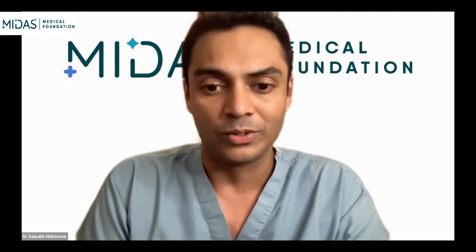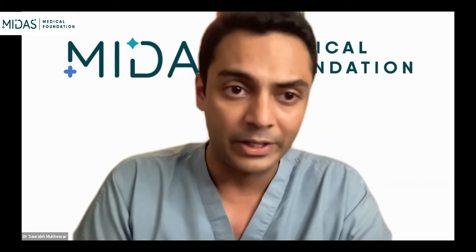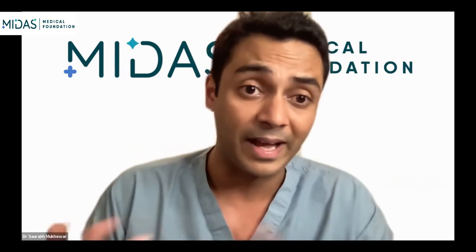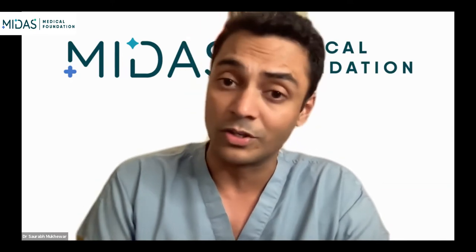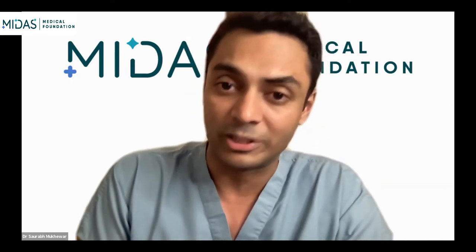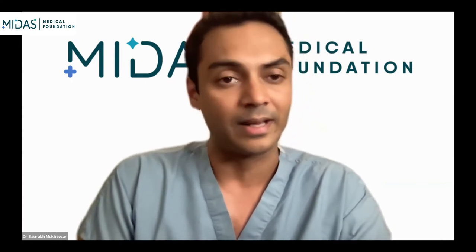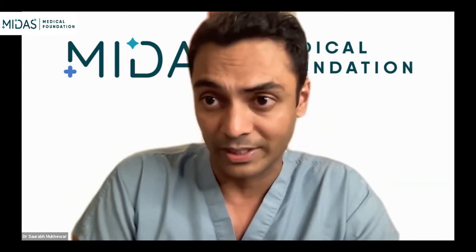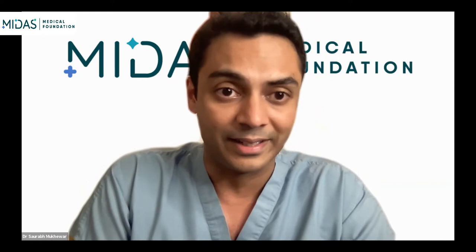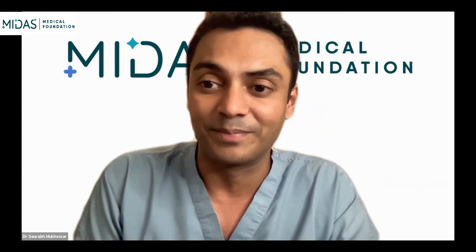There will be demonstration of how regular upper EUS is performed, and everybody has sort of different styles. We have Dr. Jayanta Samanta and also Dr. Shankar Jhavar, who is also an experienced endosonographer here in Nagpur, to join and answer questions. We do see about 140 people already, so clearly it's a popular thing to learn right now.